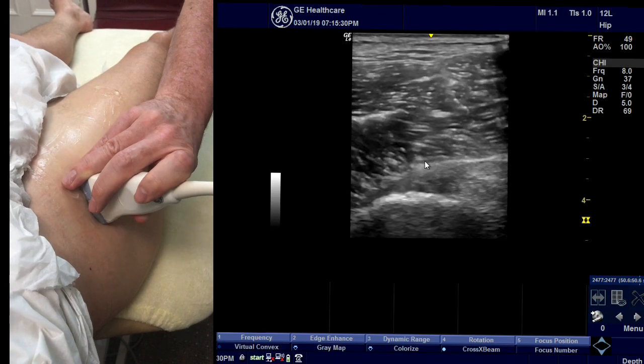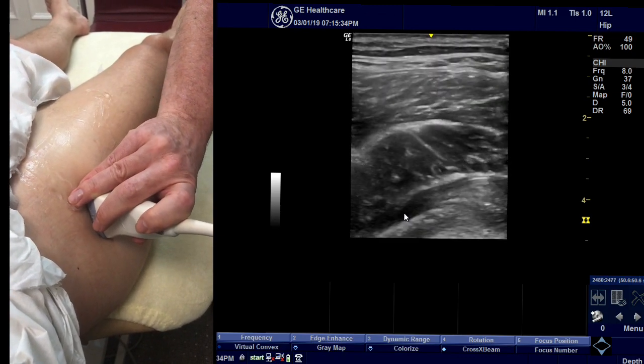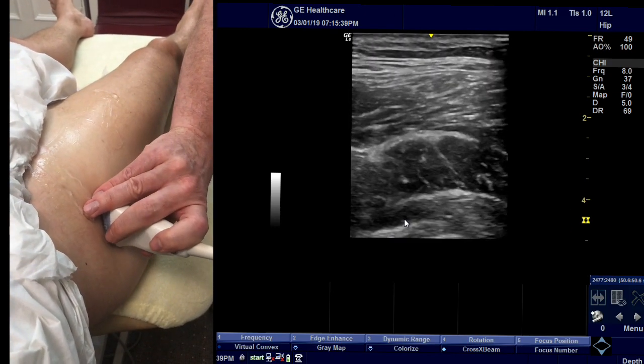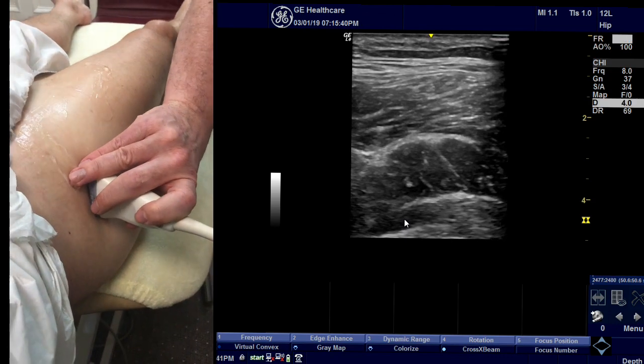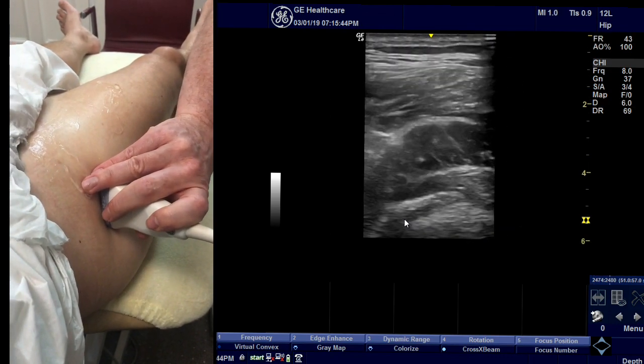You scan all the way through and follow it all the way down to its origin on the acetabulum. You can also angle in and drop your depth a little bit to see that a little bit better.